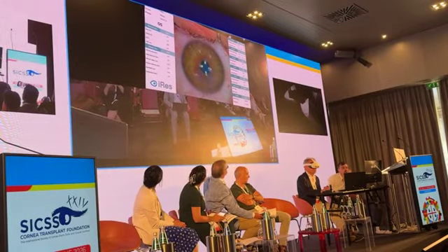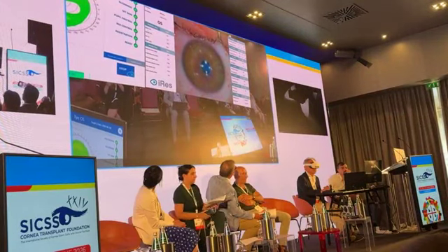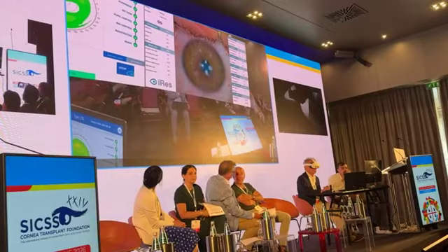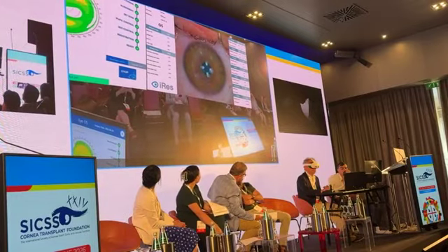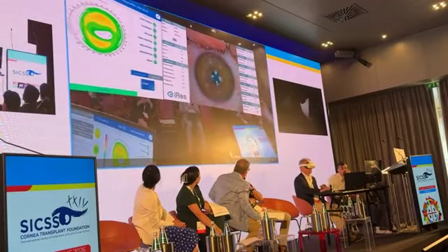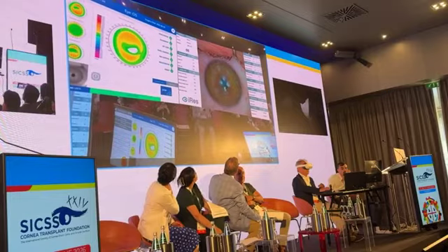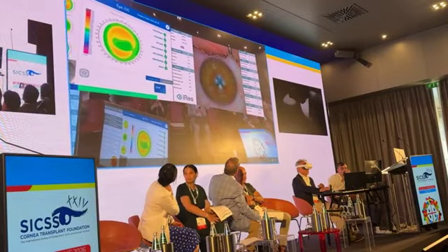You see the laser spot working on the shape of the cornea. The bar on the left shows the progress of the time. And you see that it's replicating the shape on the cornea. And then surgery is done.